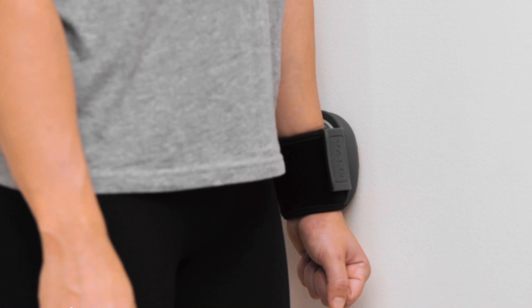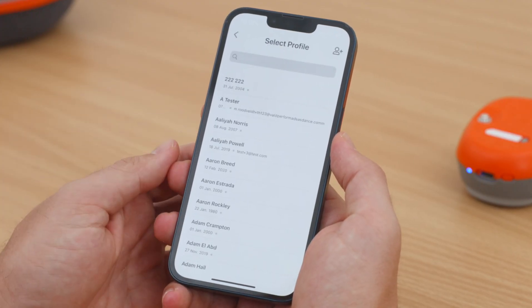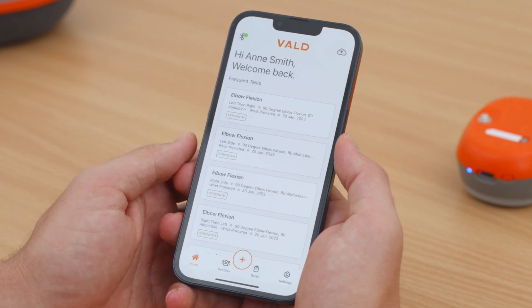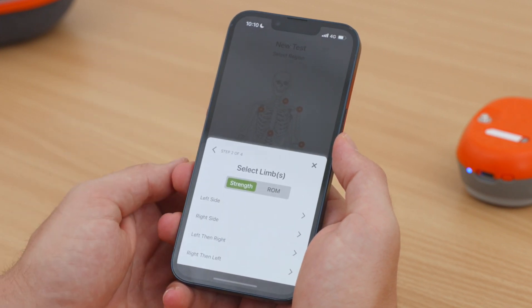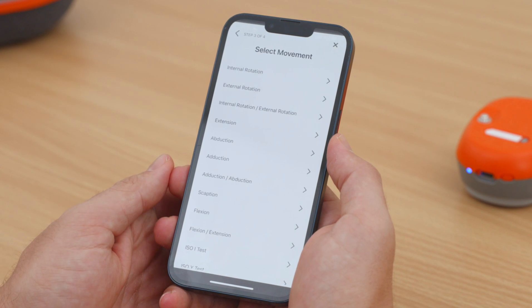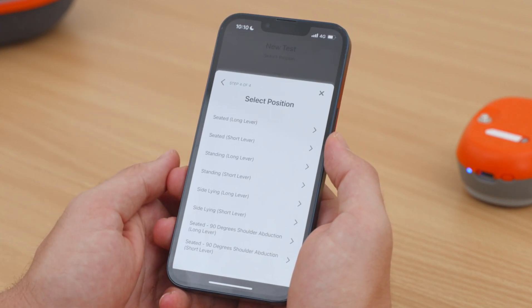Let's start with the popular shoulder abduction test. Conduct a test by clicking the Create button in the bottom navigation bar. Follow the prompts to select your profile, then choose the body area you are testing. Ensure Strength is selected, choose Left then Right Side, then select the movement — which for this test is Abduction — and the position is Standing.